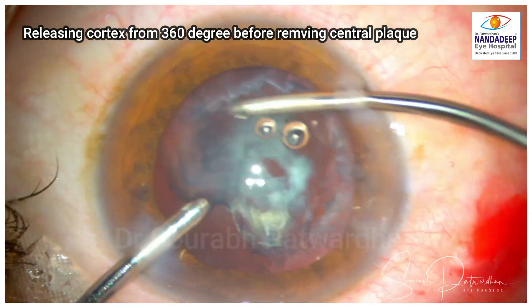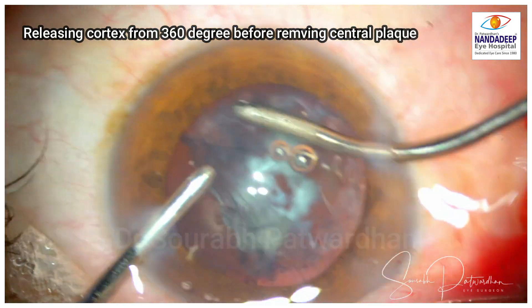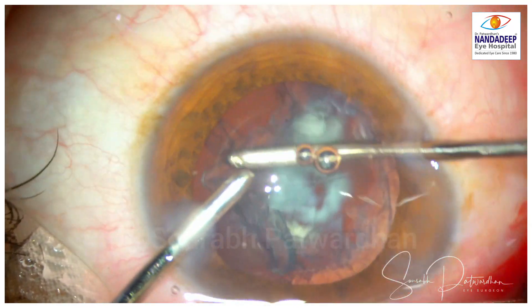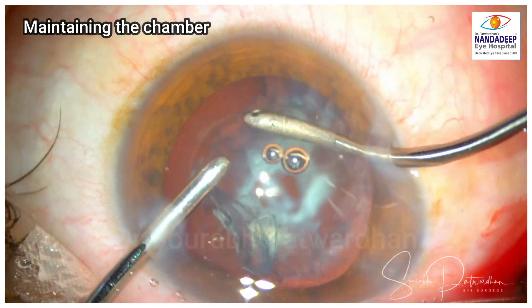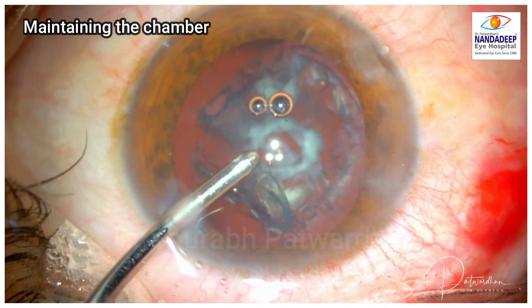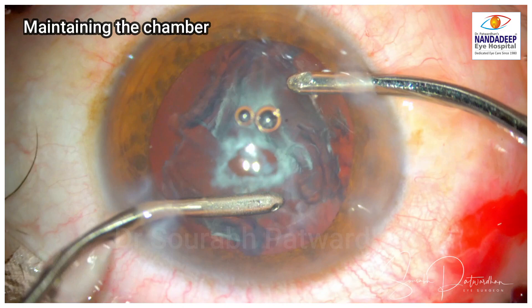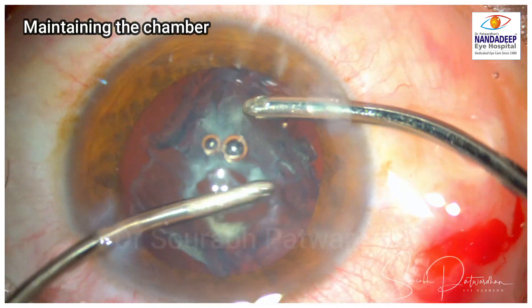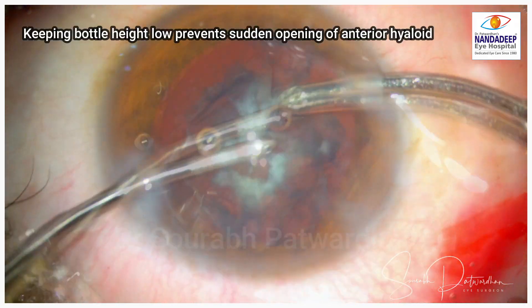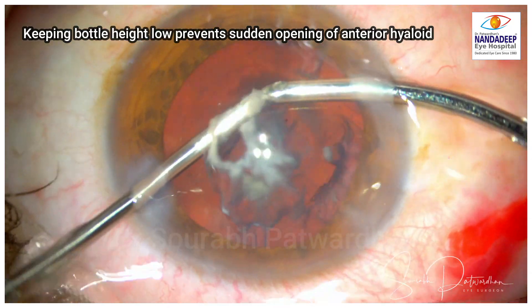Before removing the central plaque, release cortex 360 degrees, because when you remove the central plaque that is when you can have posterior capsule rupture or anterior hyaloid rupture. At that time there should be very minimal lens matter remaining in the bag. Always release the cortex from all over, then tackle the posterior plaque at the end. You can now see the posterior plaque has detached from the posterior capsule.